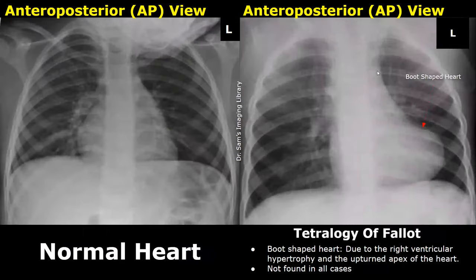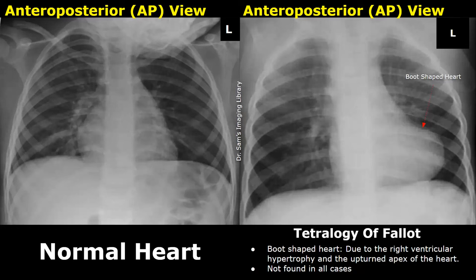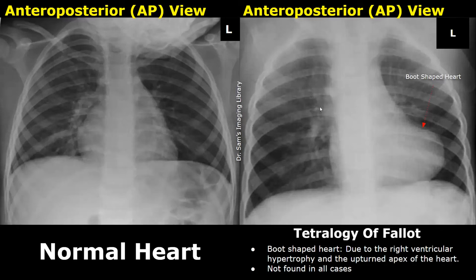Tetralogy of Fallot is a congenital heart defect consisting of ventricular septal defect, right ventricular hypertrophy, overriding aorta, and right ventricular outflow tract obstruction. On X-ray a boot-shaped heart can be seen in such patients — both these images are AP views in a child showing a boot-shaped heart due to right ventricular hypertrophy, though this feature is not seen in all cases.